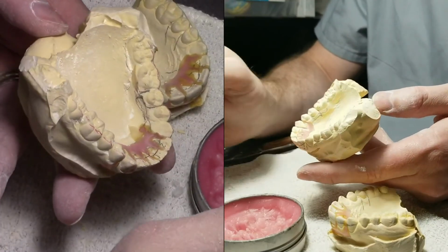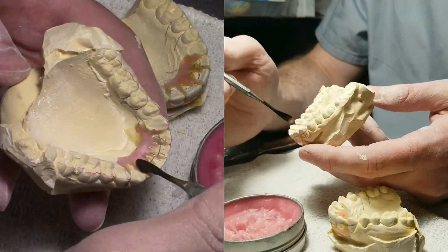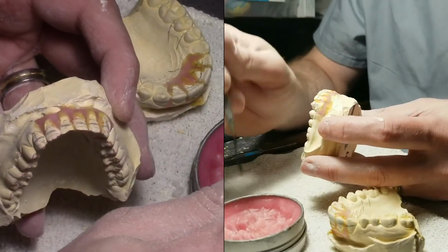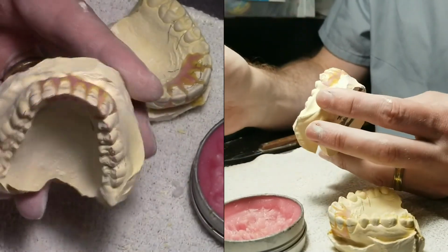Last little tip. I like to stretch the wax a little bit between the teeth. Remember, I've made a space between there, and I don't want acrylic, because this is going to get labial acrylic front and back. I don't want to get acrylic razor edge in between the teeth.